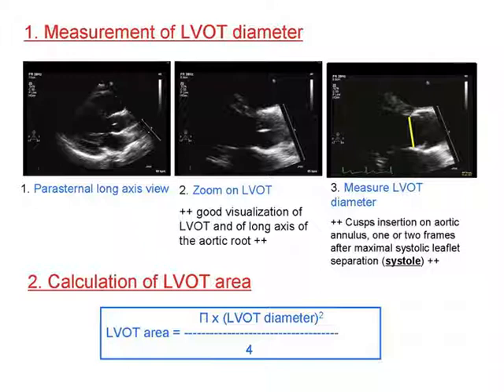So to measure the cardiac output, the first thing you do is measure the diameter of the left ventricular outflow tract. And you can see that in the parasternal long axis. So first thing you do is go back to parasternal long. Remember that? That's the RV up here, the LV over here, the LA is here, mitral valve is right here, and then the blood comes into this LV and gets pumped out this aortic outflow tract.